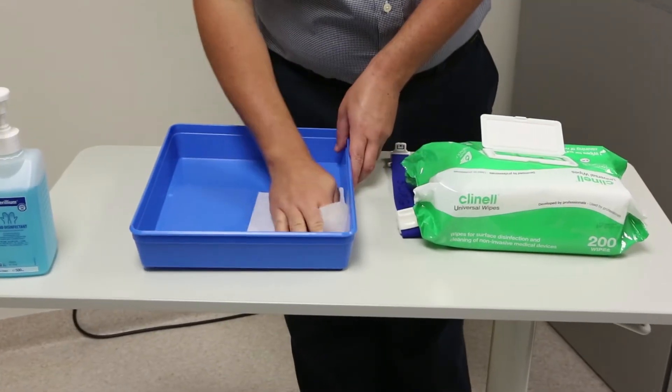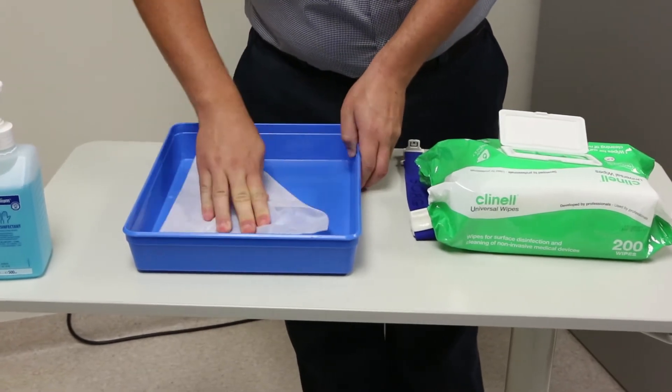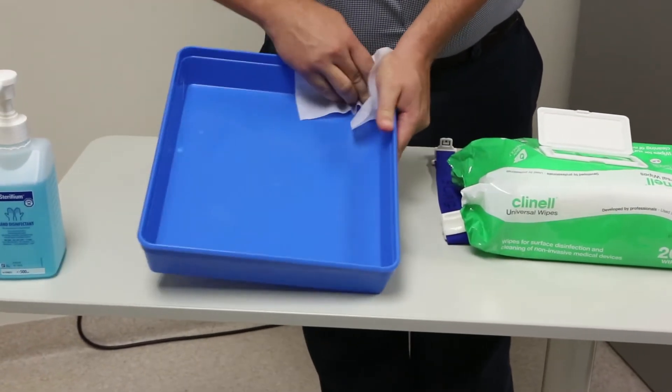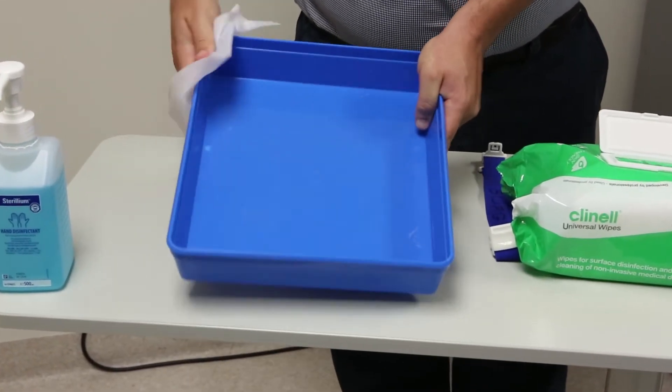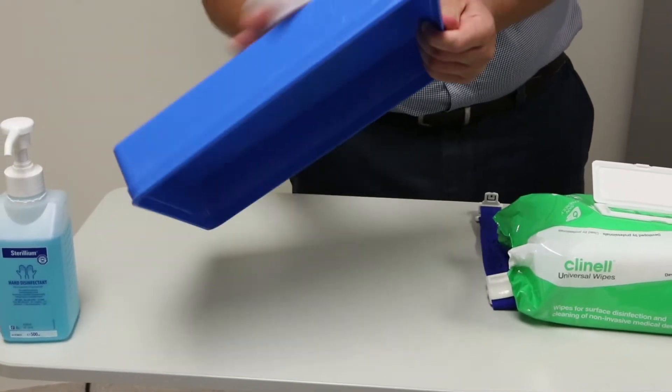Step 2. Plastic trays can be used as an aseptic field. Clean your plastic tray with 70% alcohol or detergent according to local policy. Clean the inside first, then the outside and allow to dry.